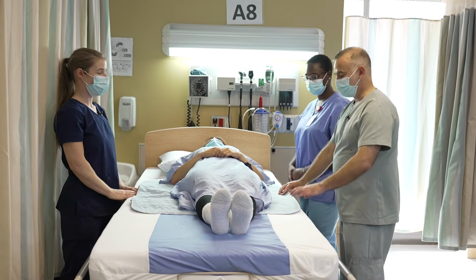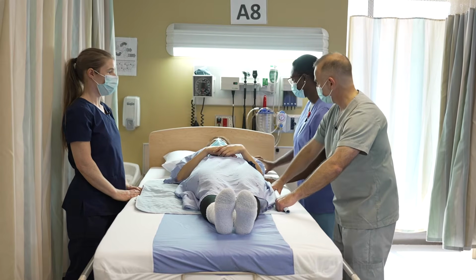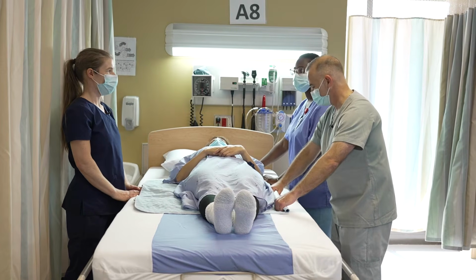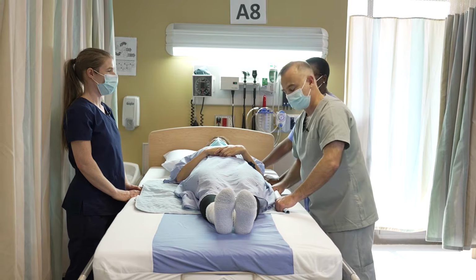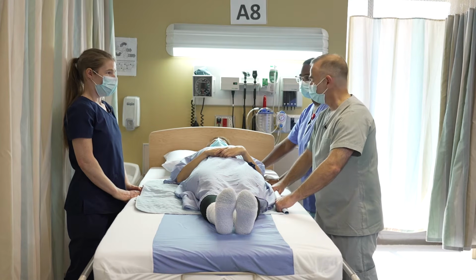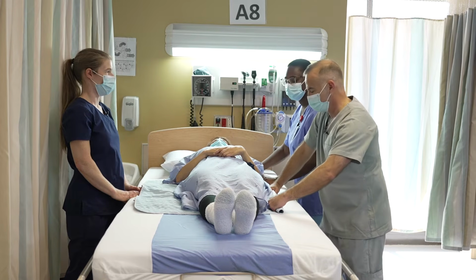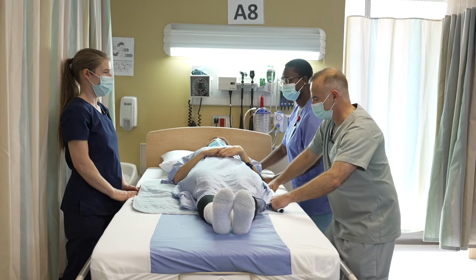Now, the two of us on this side, I'll hold the PK with two hands, and Anne-Marie will hold a PK and the pillow. We're going to be doing a forward-backward weight transfer. And I'll call on 3 for us to move. Are you ready, Mrs. Gendron? Yes. Okay, great. You ready, Anne-Marie? Yes. Okay. 1, 2, 3.